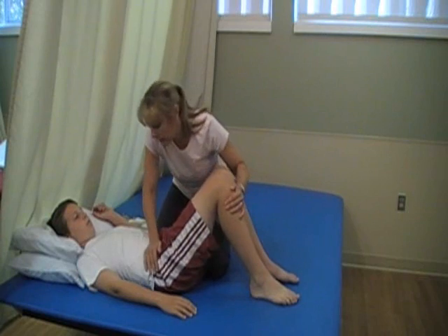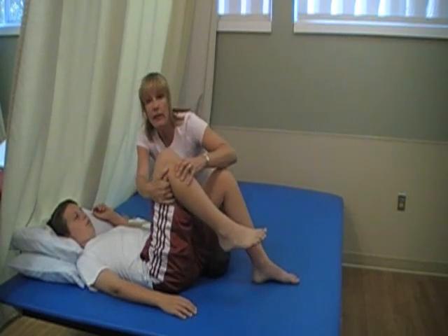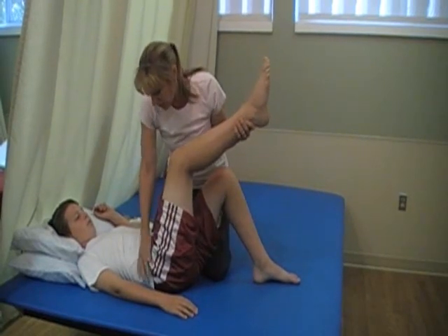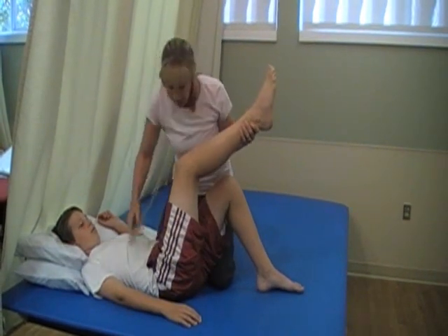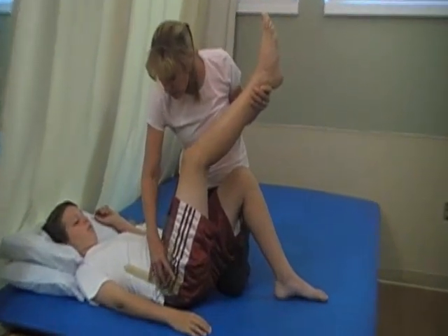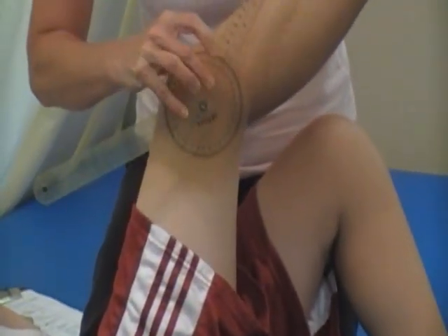So once the pelvis is in your optimal position, you want to also look at their maximum hamstring length by looking at knee extension. So with the hip and the pelvis in that optimal position, you want to look at what is the maximum hamstring length. And you want to measure that. You want to measure it both at the hip and at the knee.